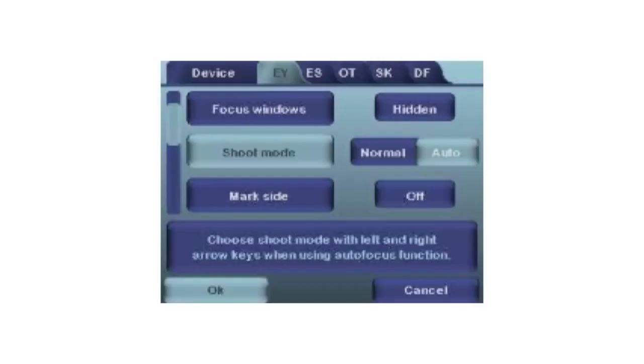With auto shoot mode, you only need to press the shutter button halfway down and the camera focuses and takes the image automatically.